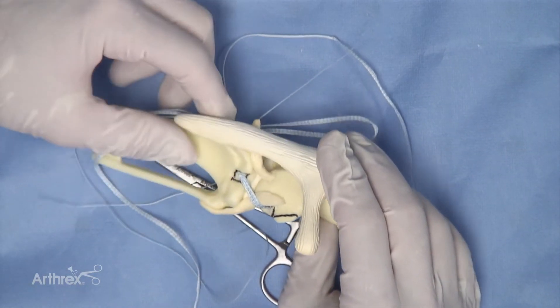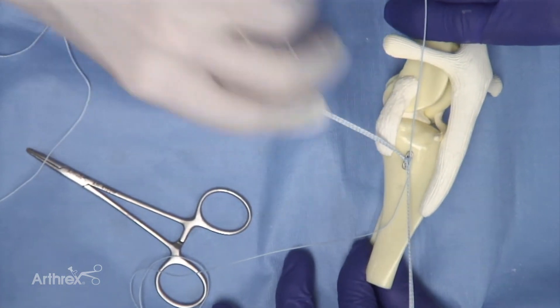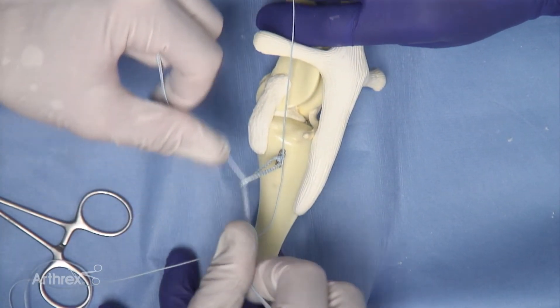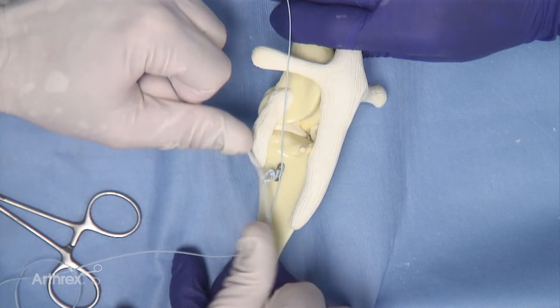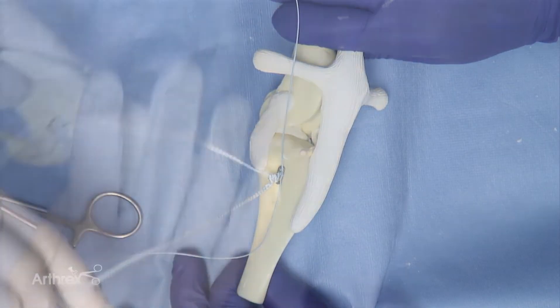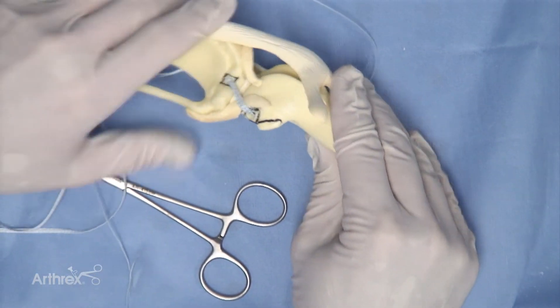This re-testing is more important in the clinical case than the model. If satisfied with position, the bow is released and a second throw is placed to produce a square knot. This knot should be tight and throws should be cinched against each other. Five to six throws are recommended to achieve a stable, secure knot. Once achieved, re-examination of the implant site and determination of tension and stability can be repeated.